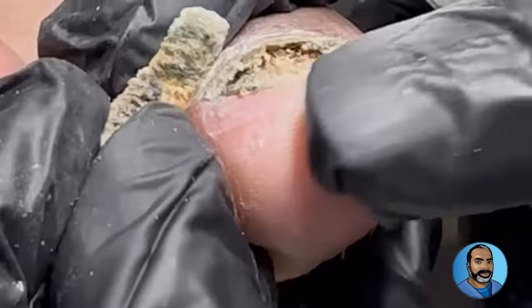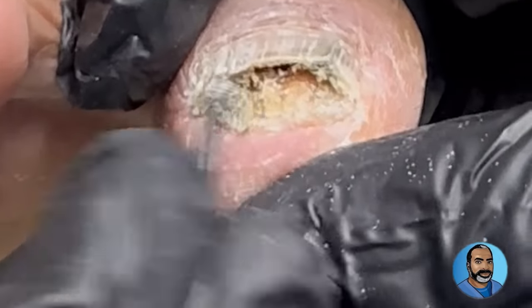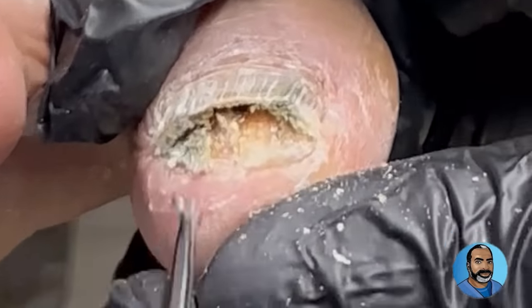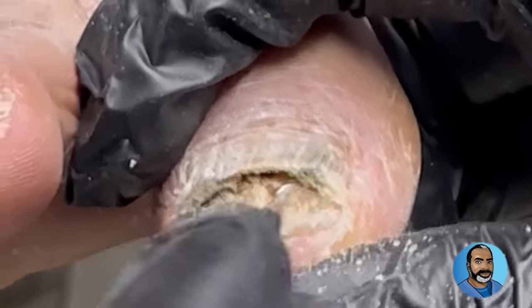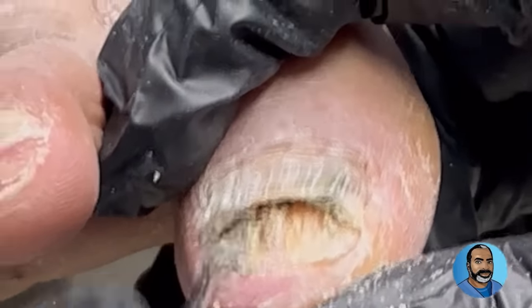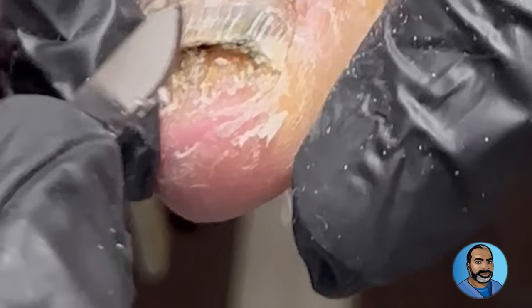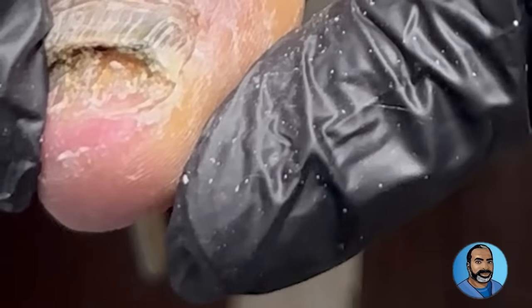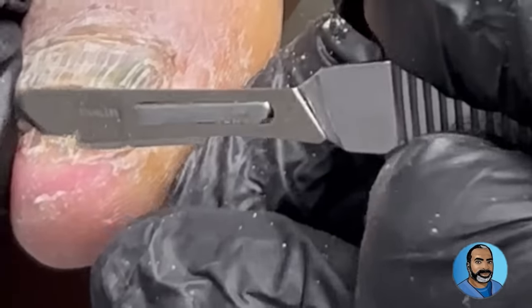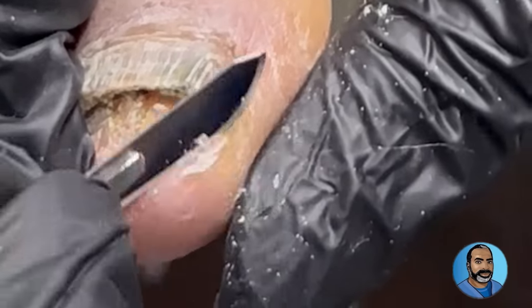There is quite a bit of hyperkeratosis, or callus-like buildup of the skin underneath the nail. There's a whole lot of subungual debris and discoloration, and it's very difficult to remove this with a curette. At this point, a scalpel is necessary to remove the hyperkeratotic, or callus-like, skin underneath the nail. It is very important to remove as much of this hyperkeratotic and fungal skin as possible so that when it's time to apply medication, the medication will have less to work against and you will have a better chance of a complete cure.